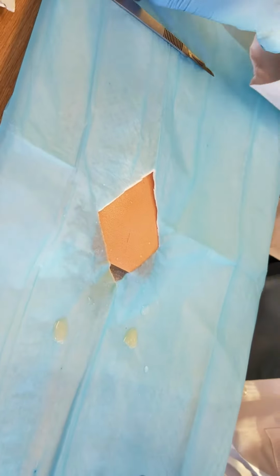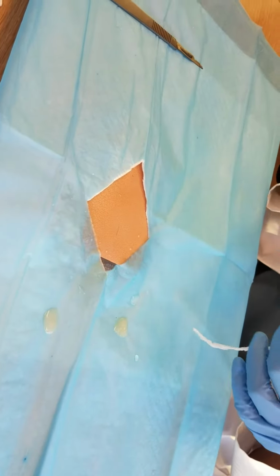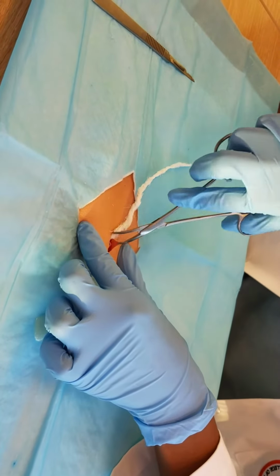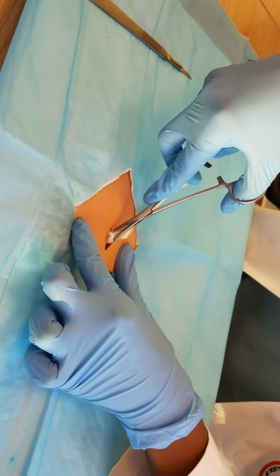And then you want to insert the iodoform gauze into the abscess with 1 centimeter of gauze exiting from the cavity. So you sort of just work your way in.